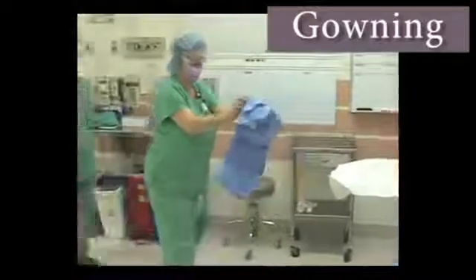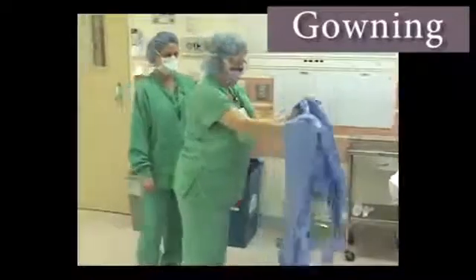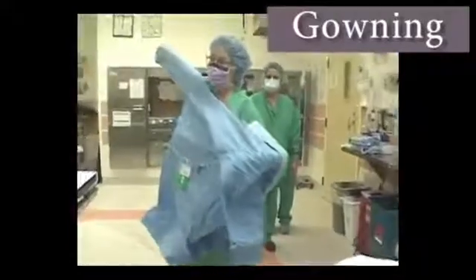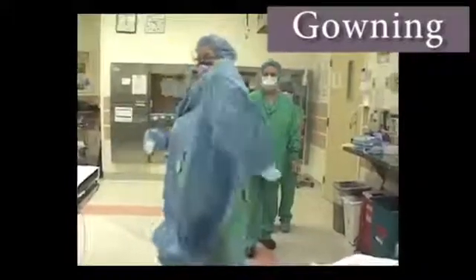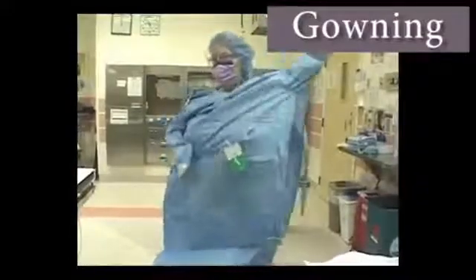Pick up the gown and allow it to unfold so it will not touch the table or any other surface or individual. Put one arm, then the second arm, into the corresponding sleeves and shrug the gown in place, then stand with arms in front and hands inside the sleeves.